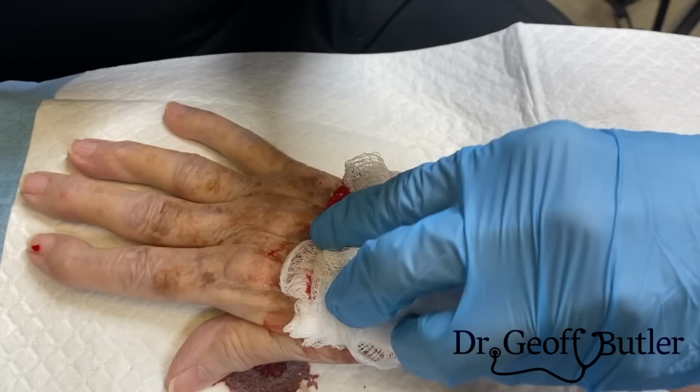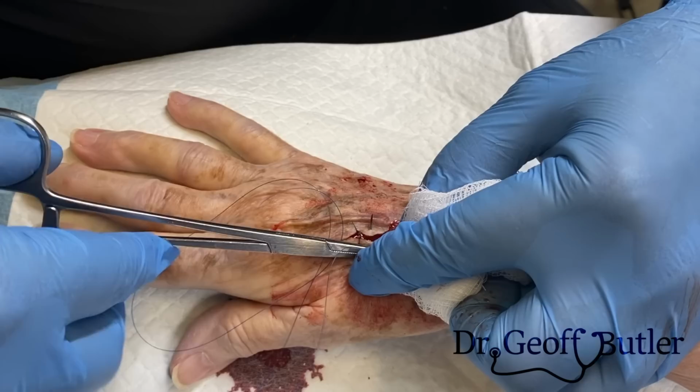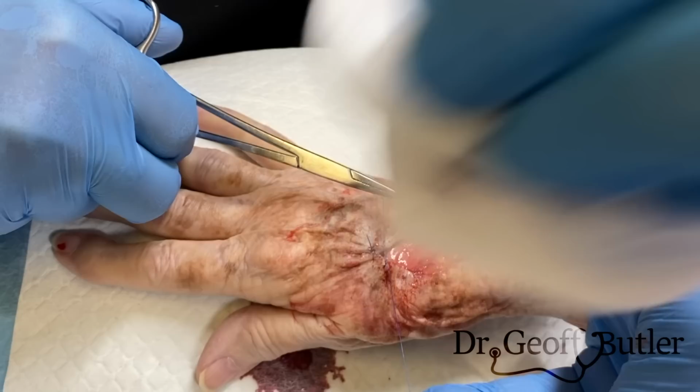The only reason I bring that up is the tendency can be to just be a little bit panicked with that. But as long as you move your way along and you put your stitches in, you'll capture it, and then that's going to cease for us. Still being sure that these lay flat, just like that.